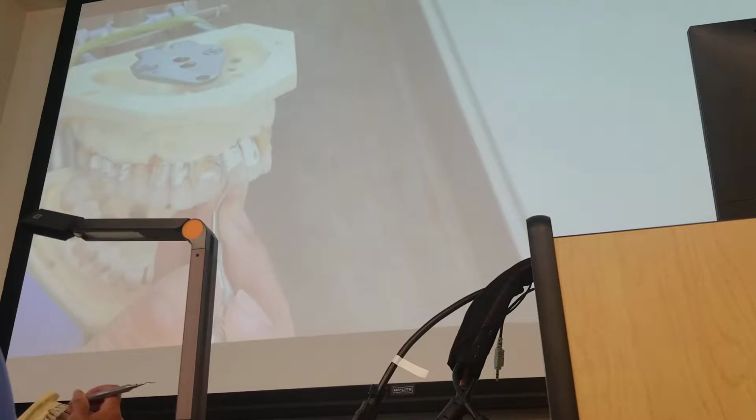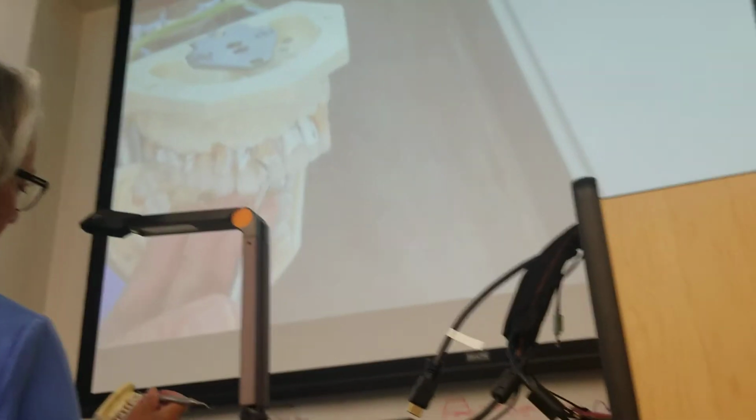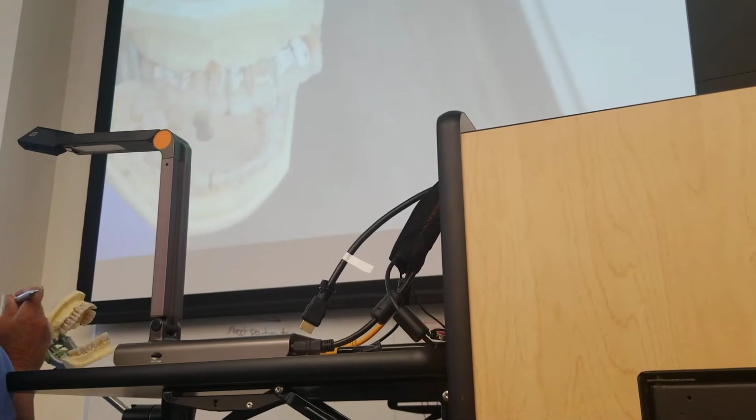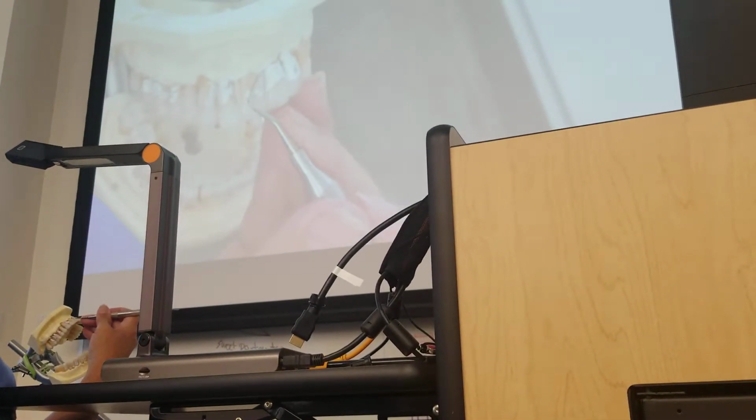So again here, you're going to go just on the other side of the midline. So the other side, anterior across.